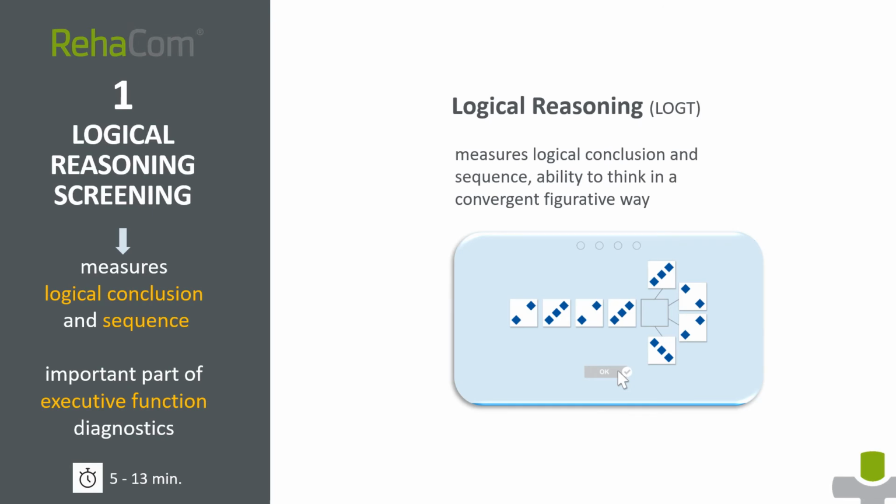The logical reasoning test is an important part of executive functions diagnostics. The term executive functions is an umbrella term comprising a wide range of cognitive processes and behavioral competencies which include problem solving, planning, reasoning, sequencing, decision making, and other competencies.